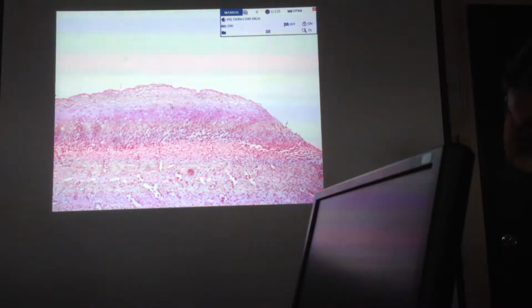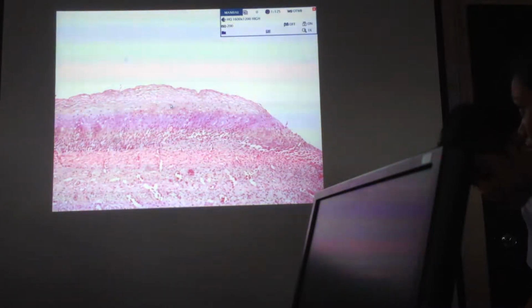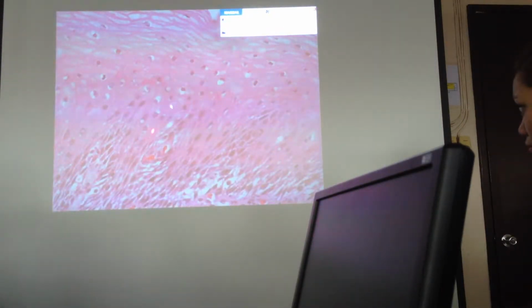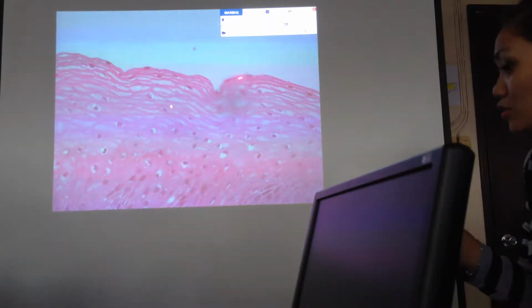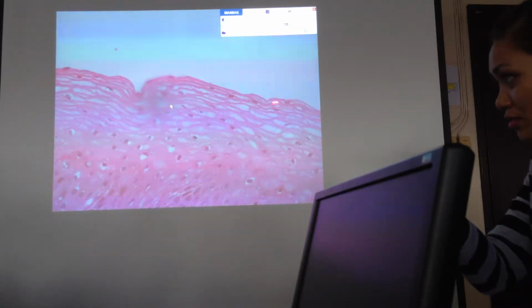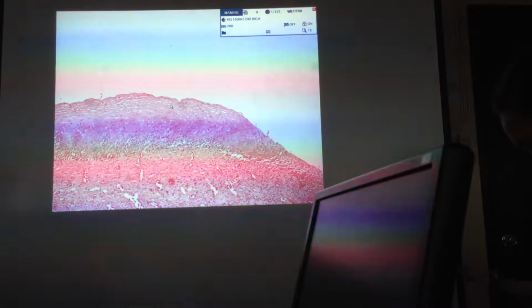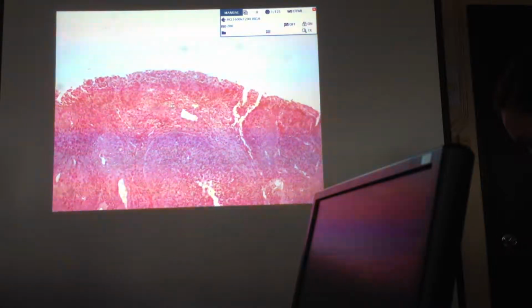So when you say you have good maturation, there will be a diminution in the size of the nucleus from the basal layer, which has the biggest amount of chromatin. And then as you go up to the stratum corneum, you would see flattening of the cell with accompanying thinning out of the nucleus. So we go to this area where you have the presence of atypia.